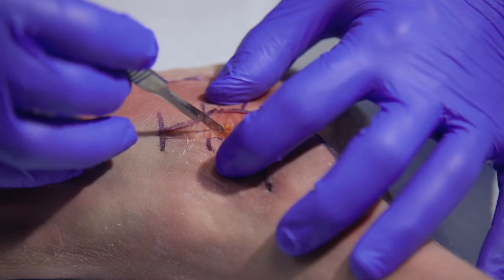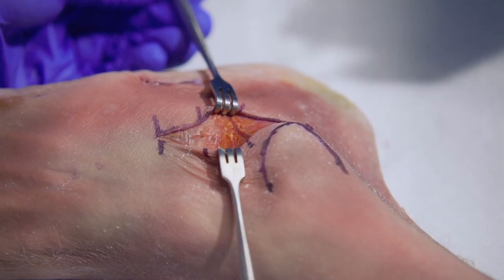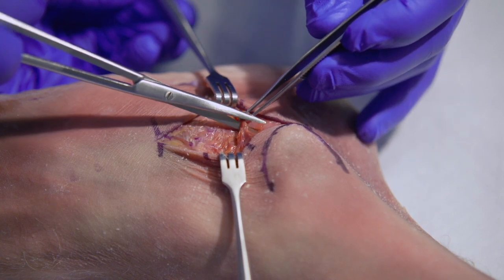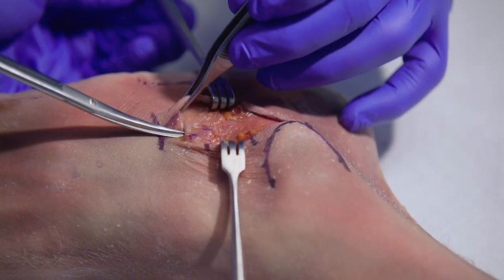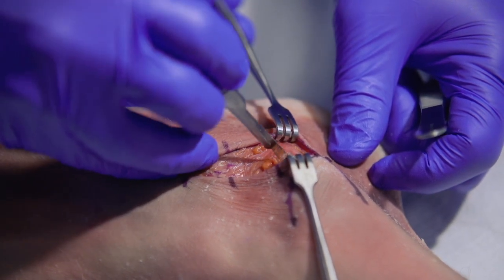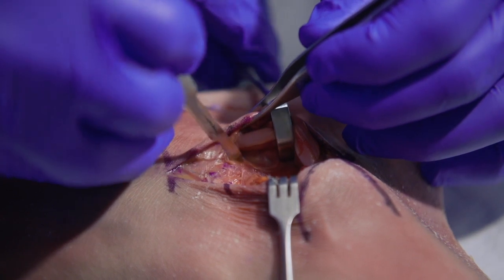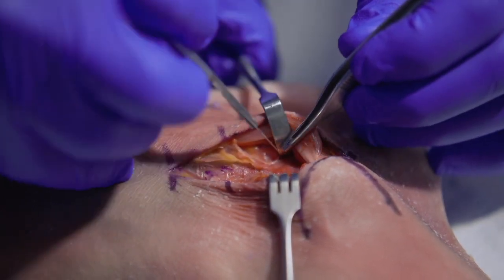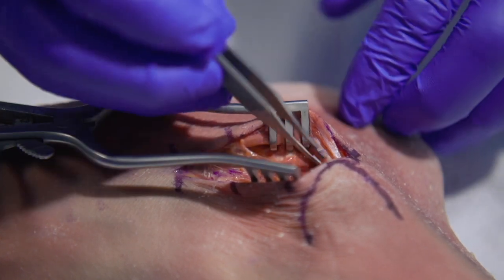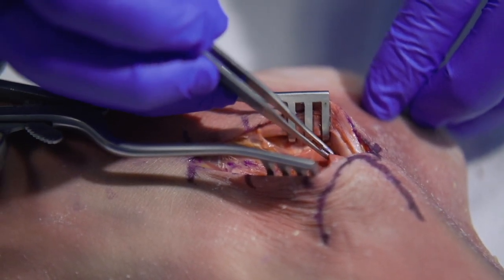The anatomy in this area is fairly limited. A branch of the sural nerve can sometimes be found over the anterior aspect of the incision, dissecting down to the peroneal tendon sheath. Once you have reached this level, you can incise the peroneal tendon sheath to visualize these tendons and retract them inferiorly. At this point you can visualize the calcaneal fibular ligament underneath the peroneal tendons, which is a good landmark for where your subtalar joint arthrotomy is going to be.